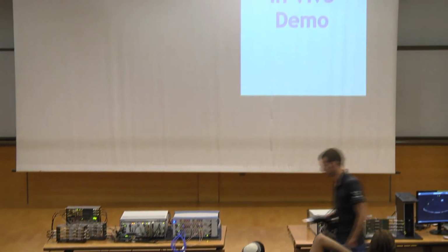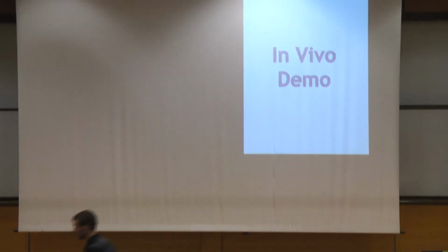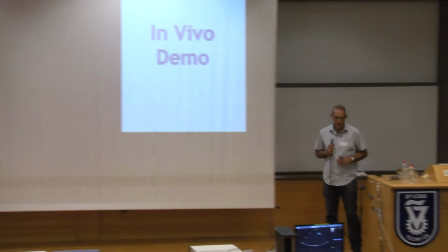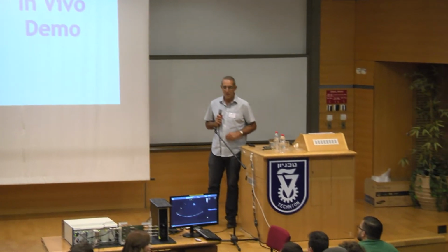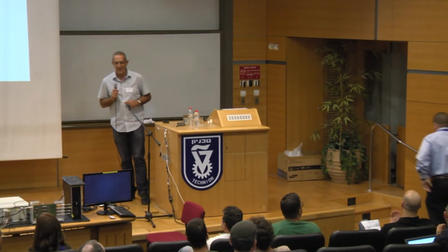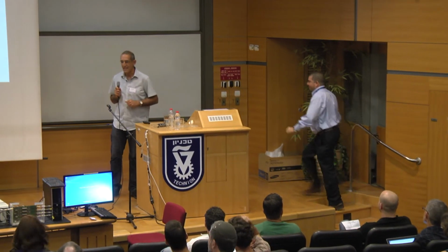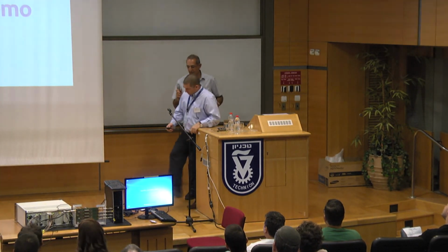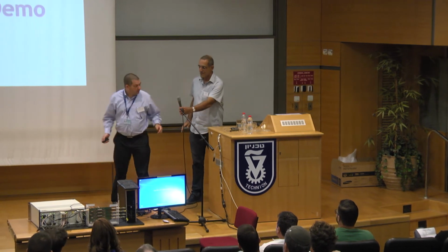Our next demonstration is an in vivo. We have started to collaborate with the Sheba Medical Hospital. And I'd like to invite Dr. Shai Taiman Yarden, who is a senior cardiologist and electrophysiologist that will describe what we are seeing in the in vivo movie. Shai, this is a microphone for you.